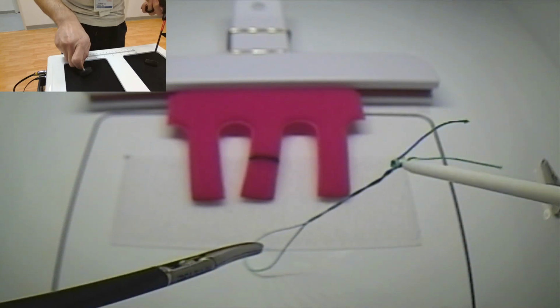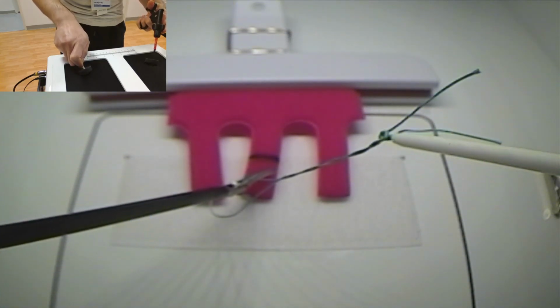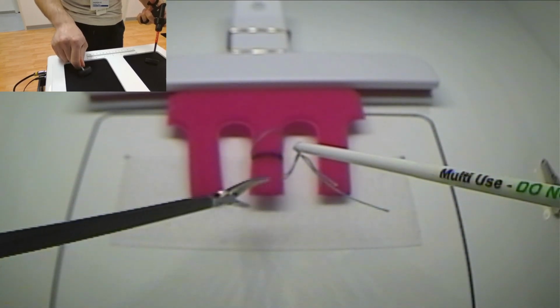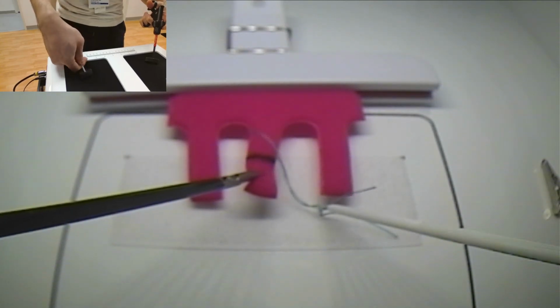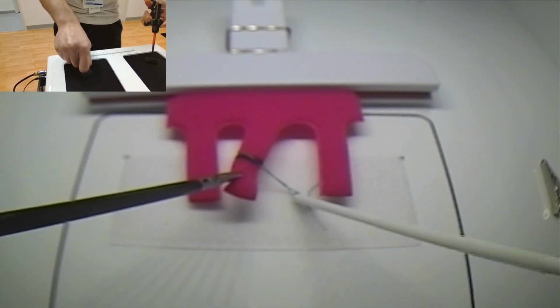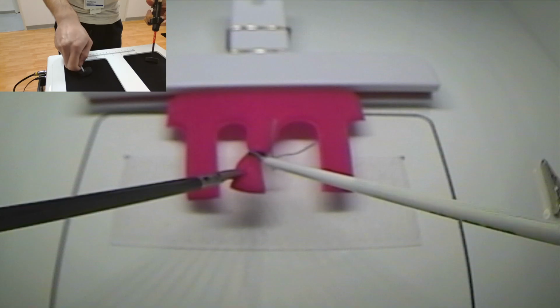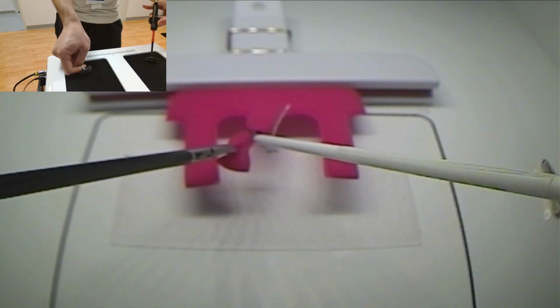And what you actually do is you go through the loop with your Maryland, then you grab the end here, and then while shrinking the loop, you try to place the tip of the endoloop around, well, it's a little short, so it can be a little difficult sometimes, but around that black line. That way the loop should guide down on there while you pull up, and then you just kind of cinch it down on top of that black line that you see there.